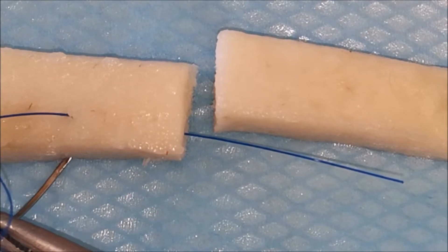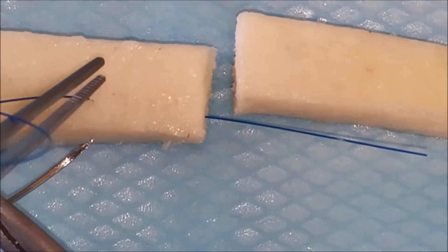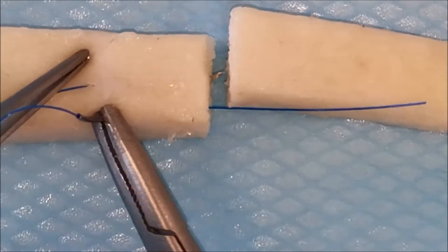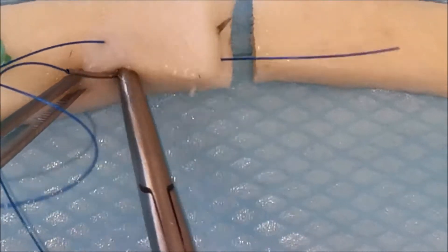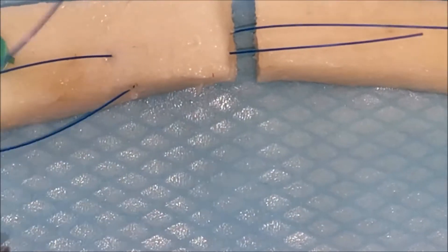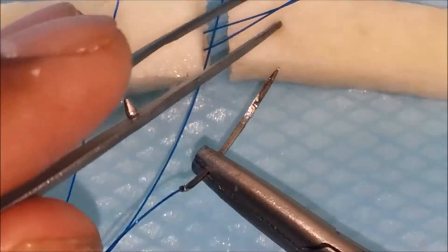When you do your grasping loop, you want at least 25% of the circumference of the tendons to be taken, and you're going in an oblique direction towards the opposing corner of your four loops.